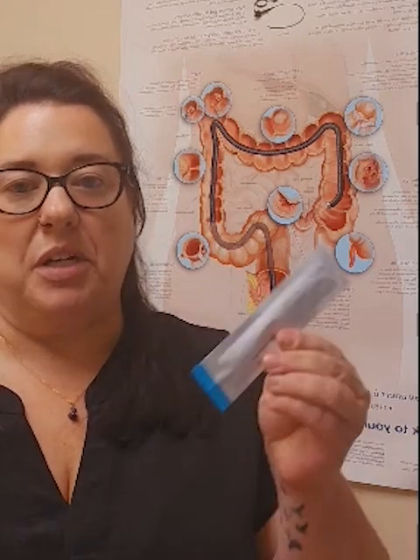You could also call companies like Hollister or Convatec and see if they have a sample kit that can be provided to you as a new ostomy patient. They also have a person that can help you decide what would be best for you to use post-surgery for your own personal needs or fit. And then give you more information about things like molding rings or strip paste.